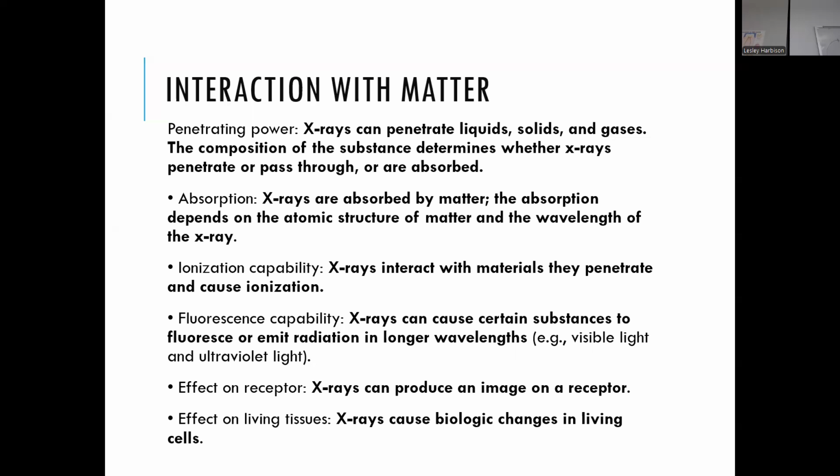CatNap is referring to, and this is in your textbook, so if anyone has a textbook and has been reading it, they might have seen a little picture. But CatNap is a way for you to remember: the C is for cathode, C is for cat, cathodes are negative, cats like to take naps. You might not have known what CatNap is, so I thought I would tell you about it first, let it marinate, and then you can write it down.